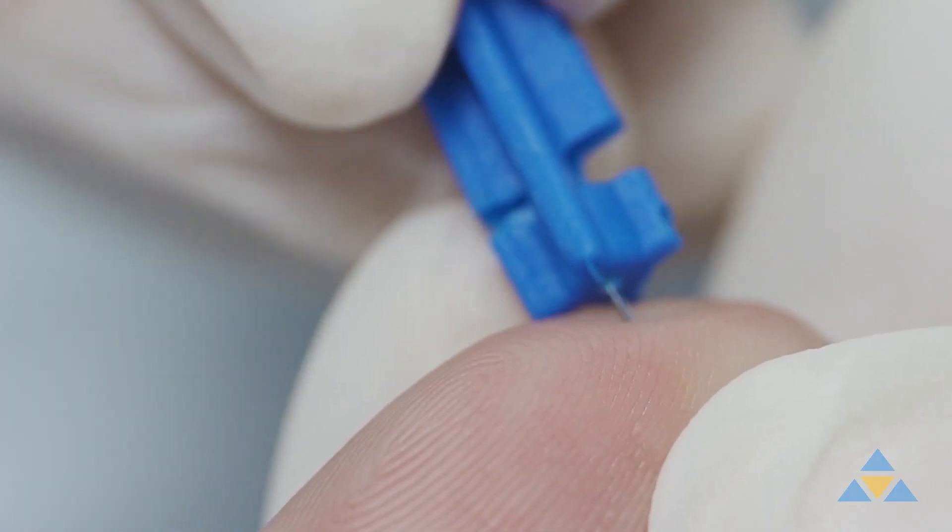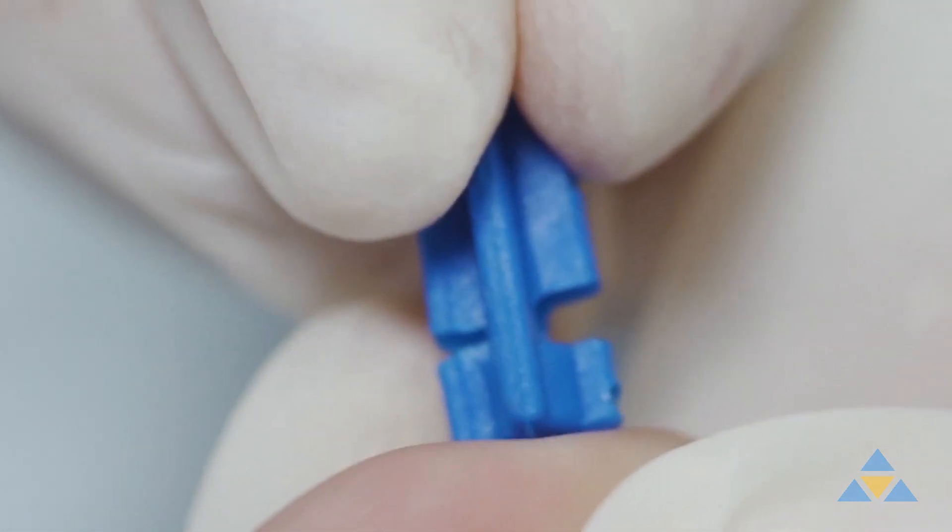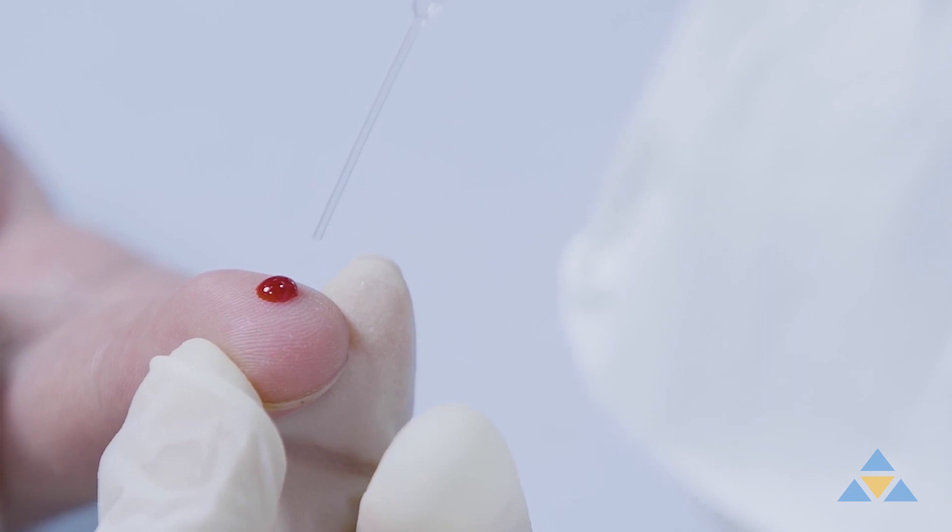Gently pinch the fingertip and use a blood lancet to draw blood. Use the provided dropper to draw the proper amount of blood.